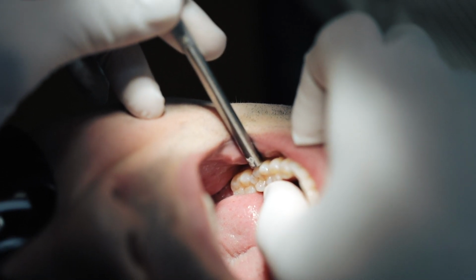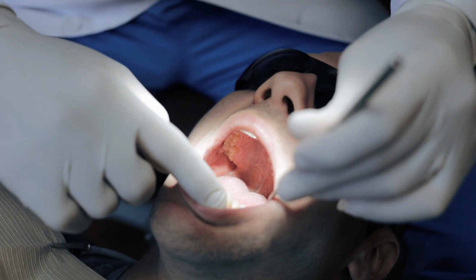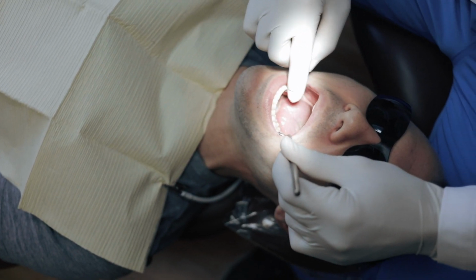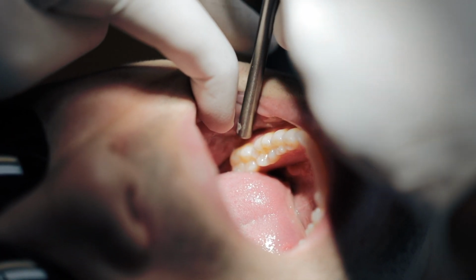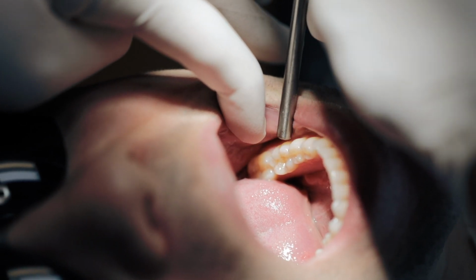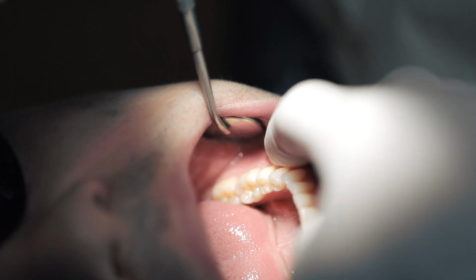Next, check for mobility and then take your mirror handle and perform your percussion test. Most of these tests will be done on 3 teeth, the suspected problem tooth as well as 1 tooth mesial and distal. Percuss the mesial tooth, then the distal tooth, and then finally the problem tooth. I wouldn't recommend you start with the problem tooth for most of your tests because you want to have a baseline reading before you load the suspected problem tooth.